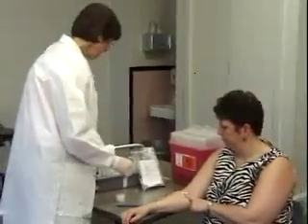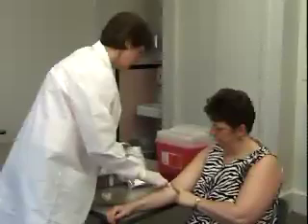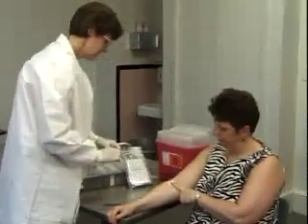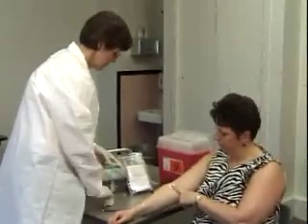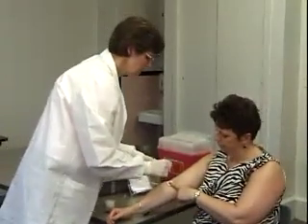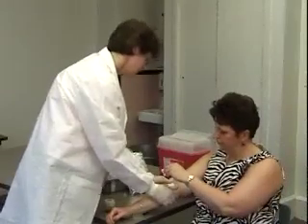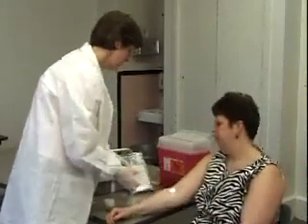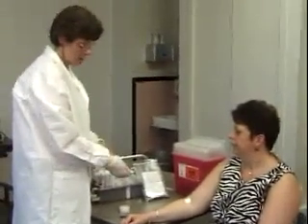I'm going to put a clean piece of gauze on her arm and a little piece of tape. Ma'am, you can take the tape off in about 30 minutes after it's stopped. You want to make sure that you remove your gloves and wash your hands between each patient.